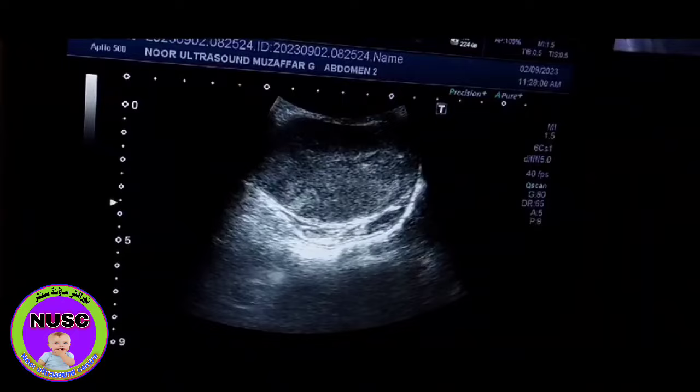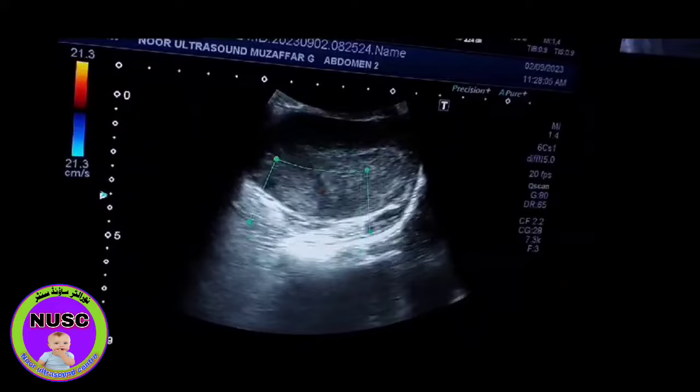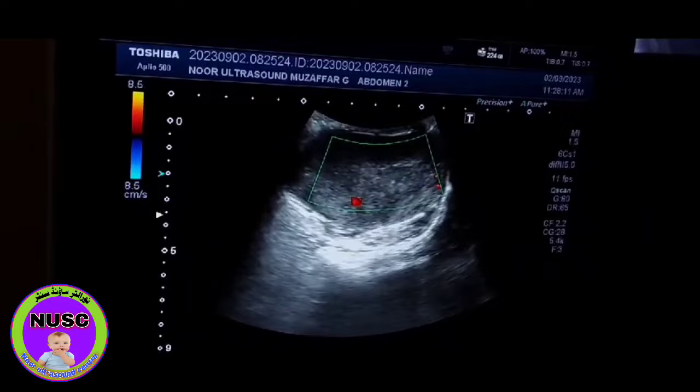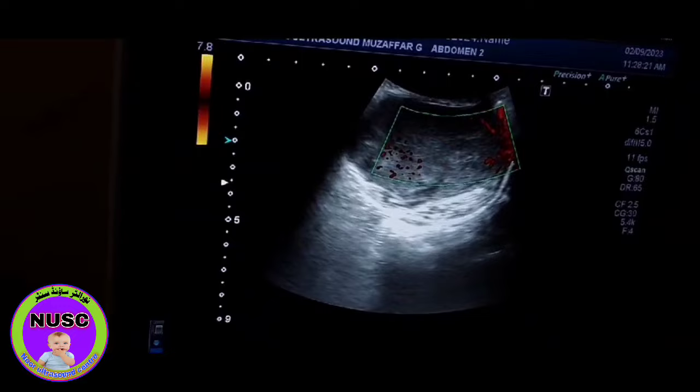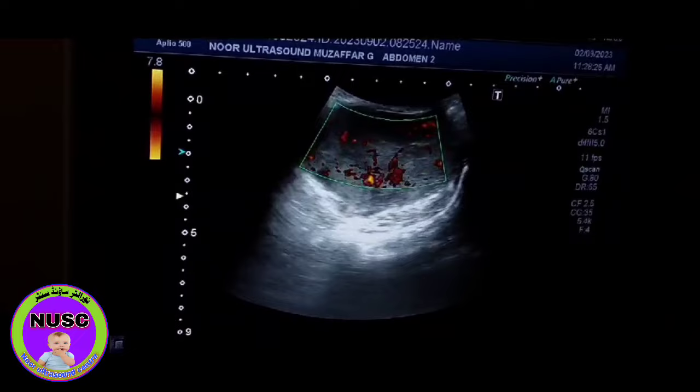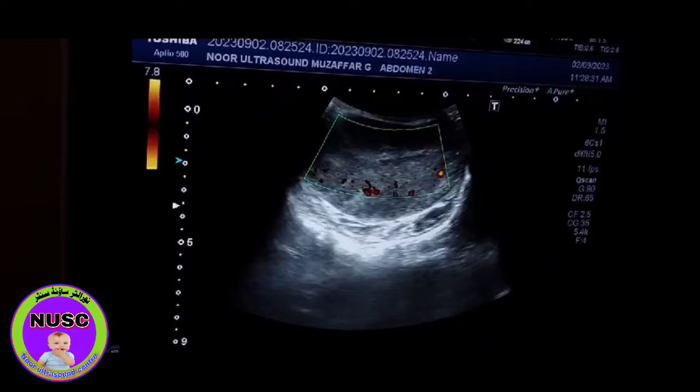This is a solid vascular mass as you see here. It is highly vascular. There is markedly increased vascularity in this mass in the left side of the scrotum.